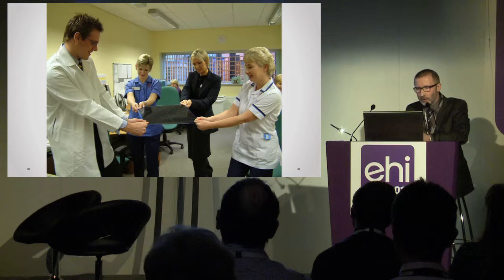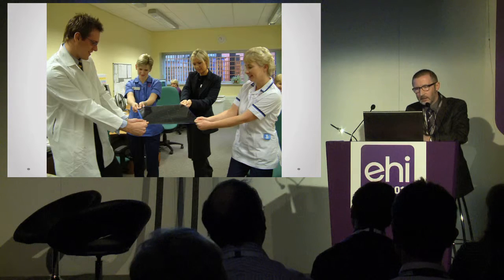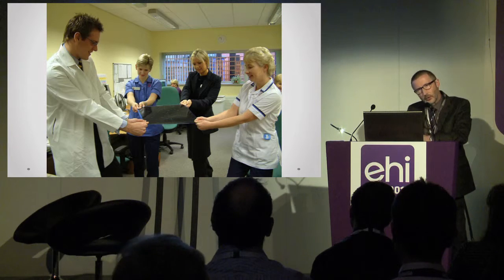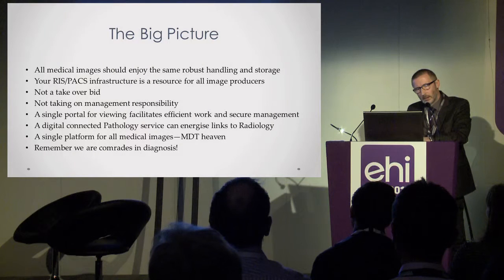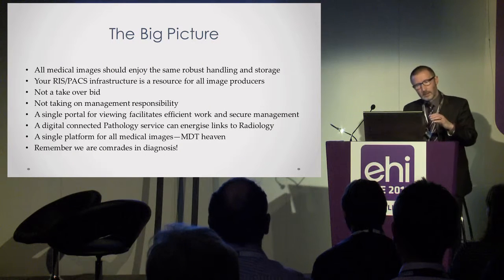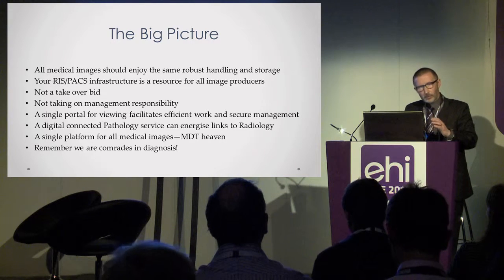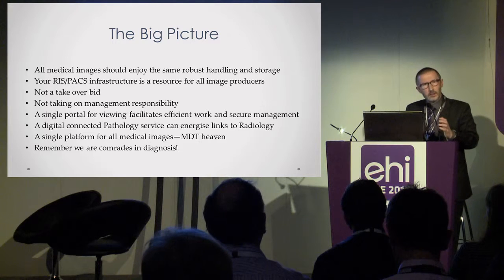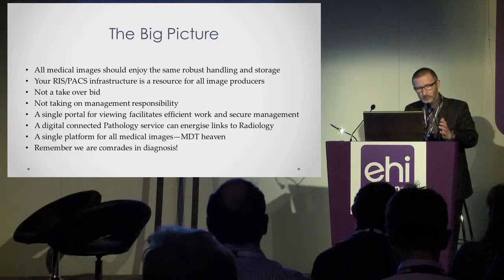So nobody in radiology would like to go back to the days of multiple simultaneous demands for access to the data, and we don't miss the perpetual fight for the celluloid. So let's make sure everyone else in our health service has the same benefits. So the big picture really is that your RIS-PACS infrastructure is a resource for all image producers. And that robust handling and storage that you enjoy for your radiology images should be available to everyone.